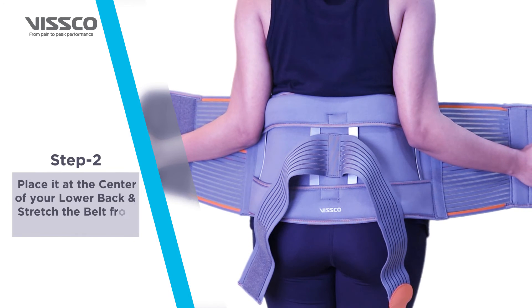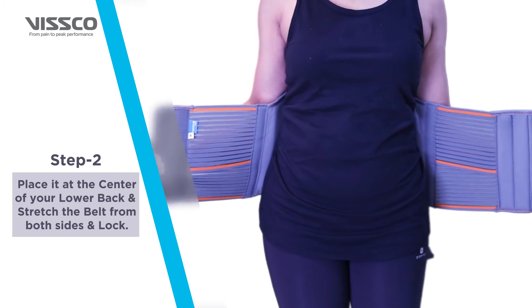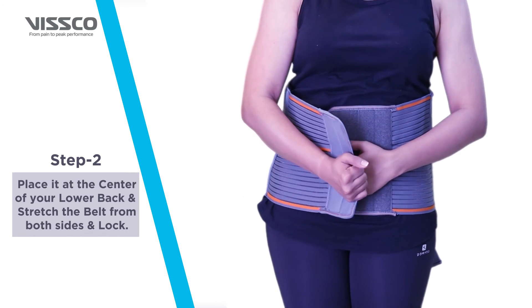Next, place it at the center of your lower back. Make sure the frame of your belt covers and supports from the sides of your lower back. Now lock the belt to a comfortable and snug fit.